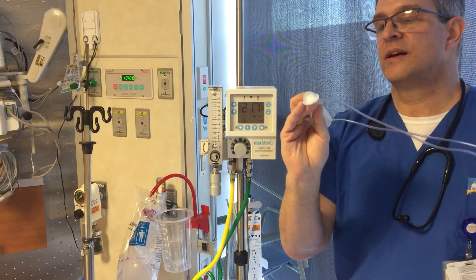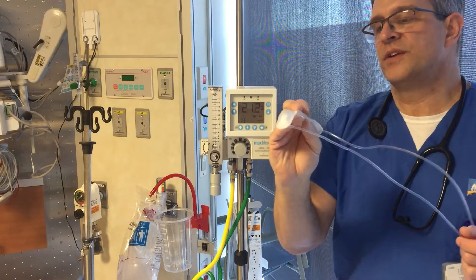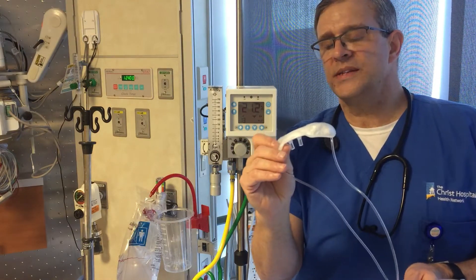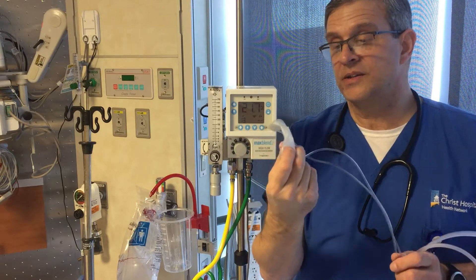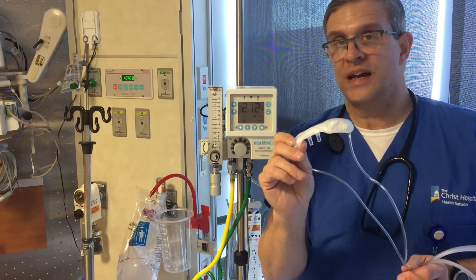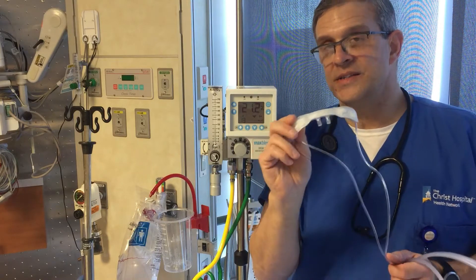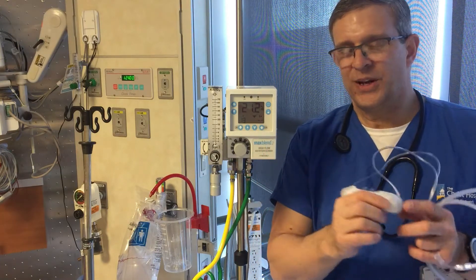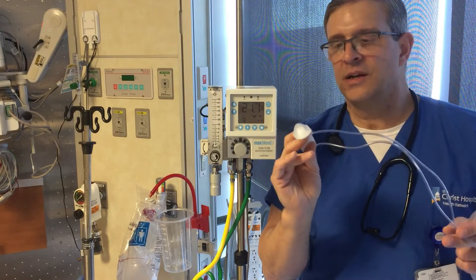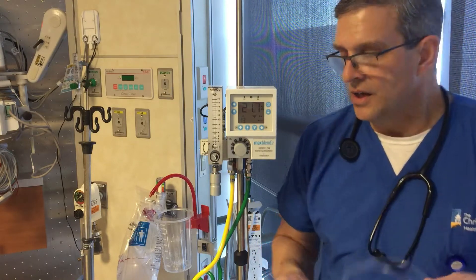Then we have a reservoir cannula — this is an oxymizer, and there are different ones out there. It was originally designed as an oxygen conserving device because you can get similar FiO2s using lower flows, so it was great for home care. But you can also run these at higher levels, so sometimes you'll hear people call this a higher flow cannula, though that's not really proper terminology.